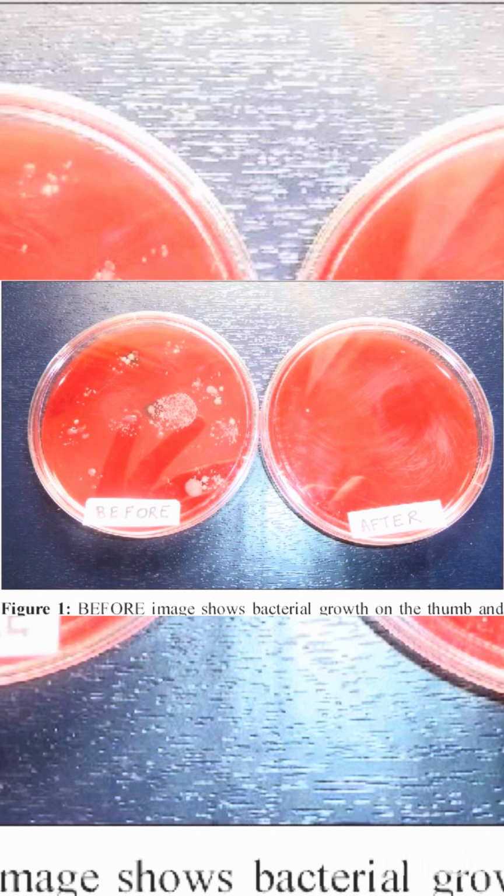This image will give you a visualization on why proper hand washing is very important, because as you can see before the hand washing, there's a lot of bacterial growth, but after the hand washing, there's little to no growth. So it's important that proper hand washing is handled.